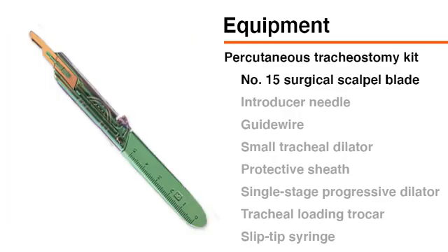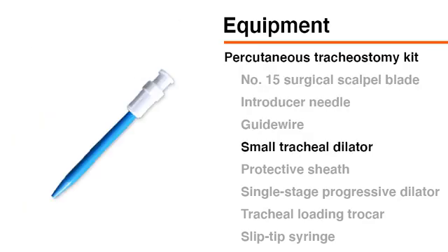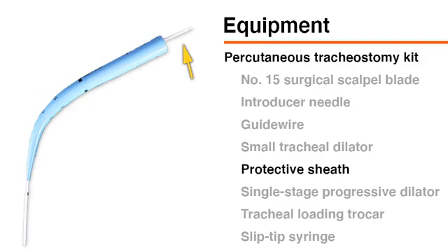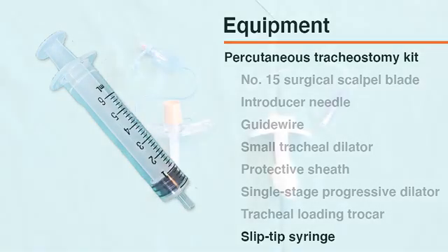A percutaneous tracheostomy kit generally includes a number 15 surgical scalpel blade, an introducer needle, a guide wire, a small tracheal dilator, a protective sheath, a single-stage progressive tracheal dilator, a tracheal loading trocar, and a small slip-tip syringe.